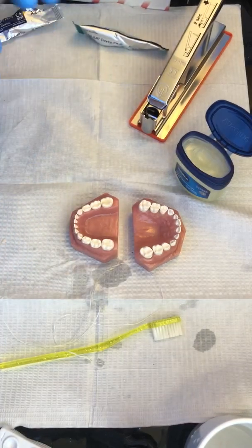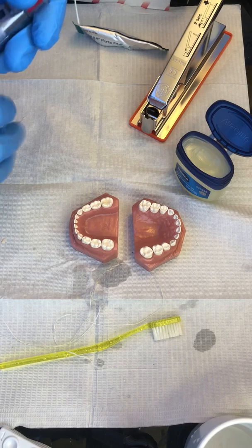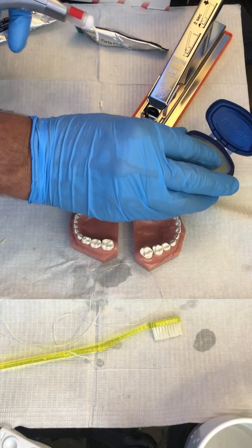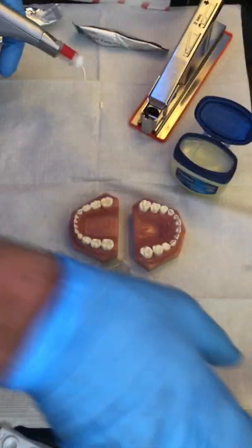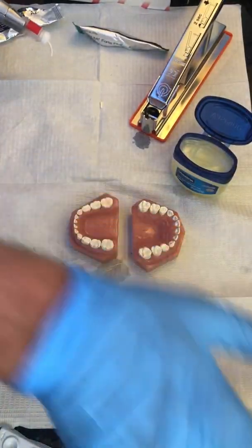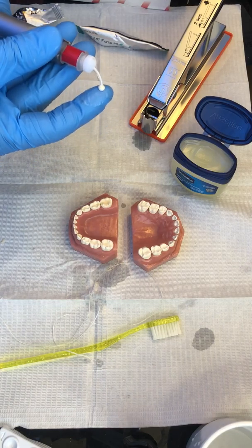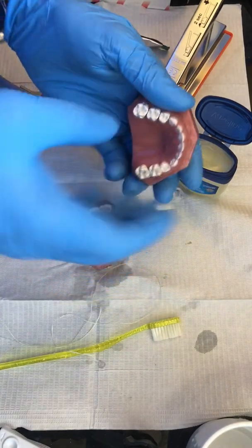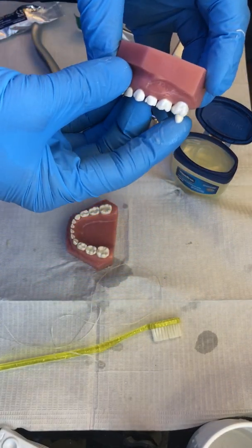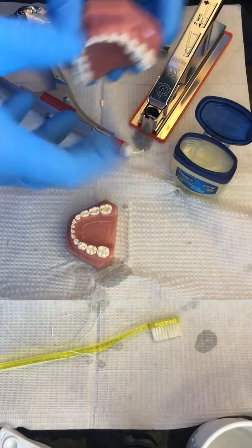Thankfully you can use the same gun to extrude all these materials. We like to have a little bit of Vaseline — not too much — on our fingertip, and of course the teeth should be moist. Since this kiddo doesn't really have saliva we need to help him out with that. For upper molars you just push on, push on, push on.